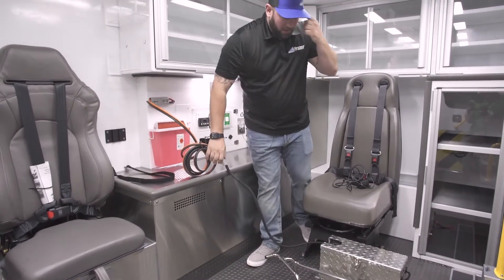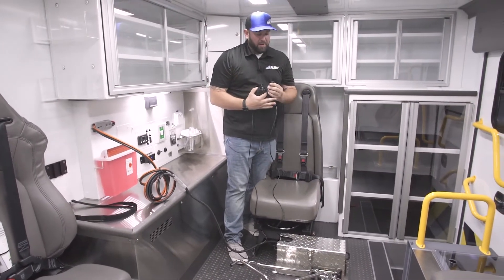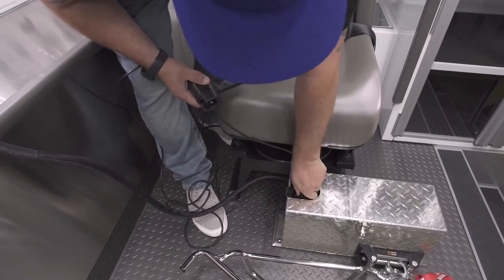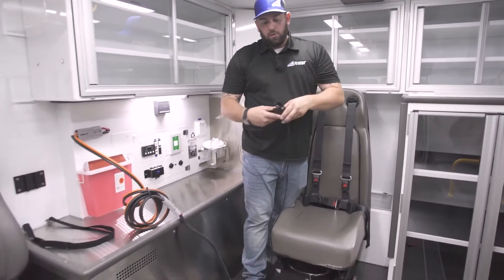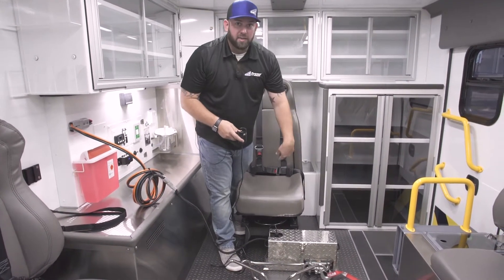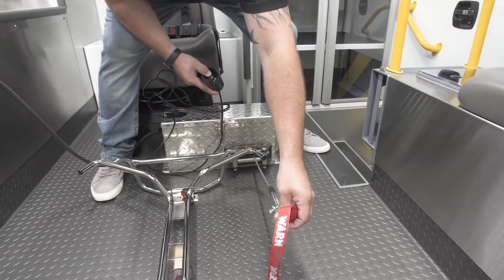Now we're powered. The remote control has about a 10-15 foot cable on it. The plug matches up with the plug at the top of the winch and simply slides into place. We have power now, and using the toggle switch — which shows an icon for cable going out and cable going in — you can extend and retract the cable. This will hook up to the lower portion of your bariatric stretcher to pull the stretcher all the way into place.